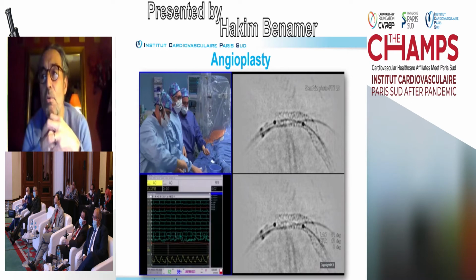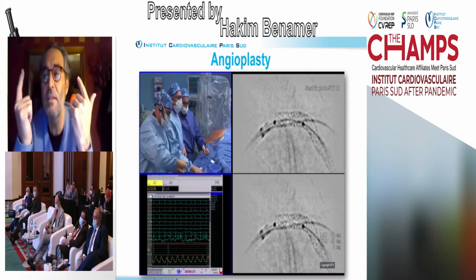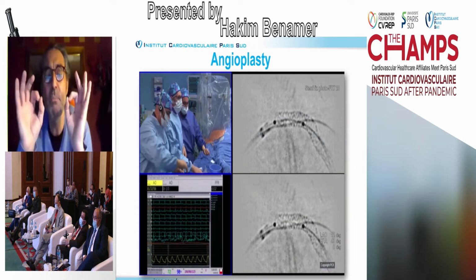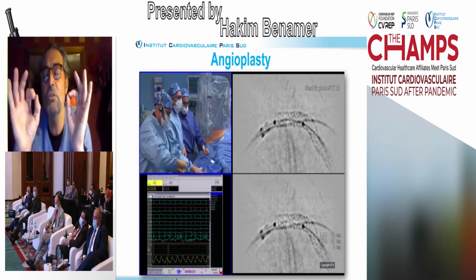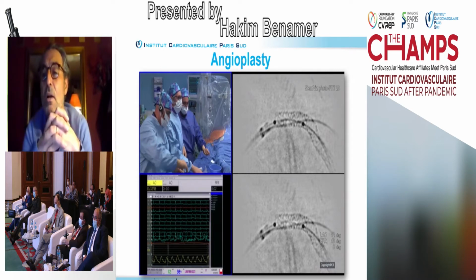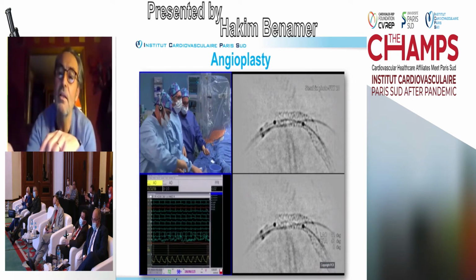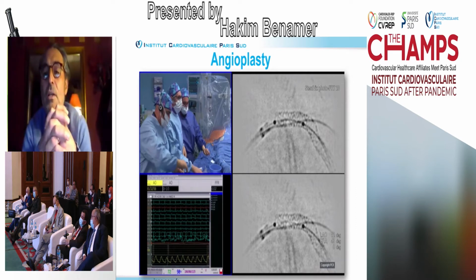The second point to keep in mind is that when you have the ostium covered with a stent, longitudinal compression can be a problem for treating the left main distal bifurcation, because you have 2 balloons, and in this case 3 wires.